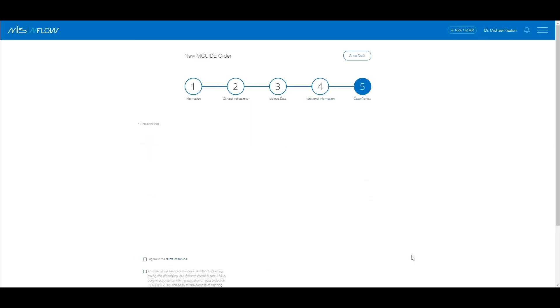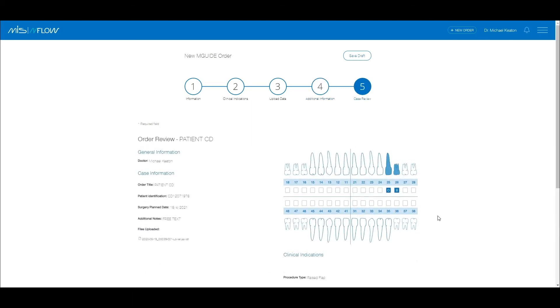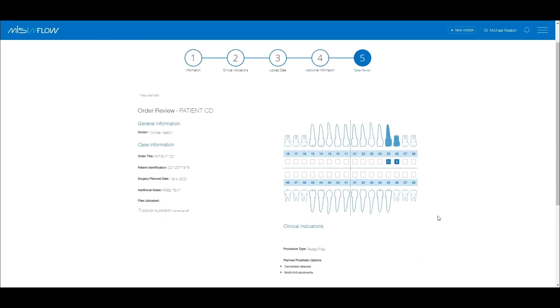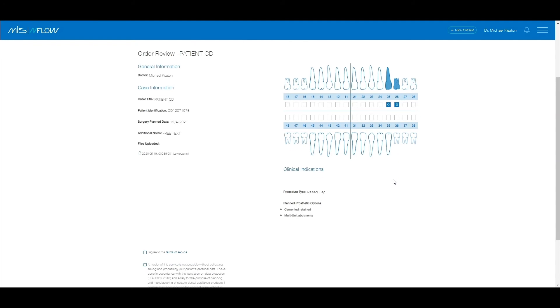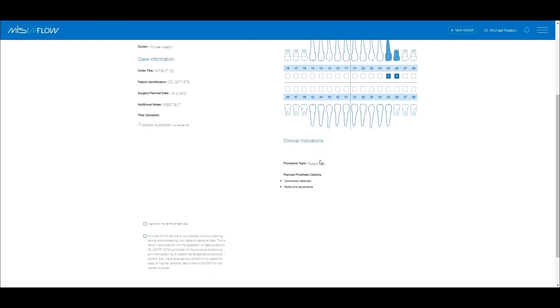We recommend that you review the order at this point. Go through the details and see that you are satisfied with all the information. In case you want to make changes, go back to the relevant section and make the changes there. At this point, you need to check the Terms of Service and Privacy Policy boxes and press Create Order.